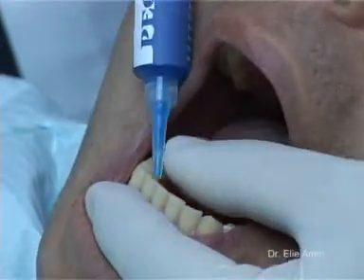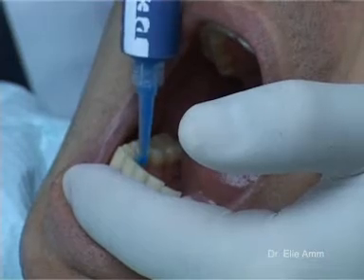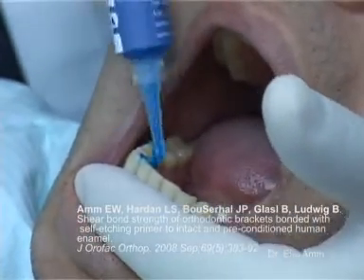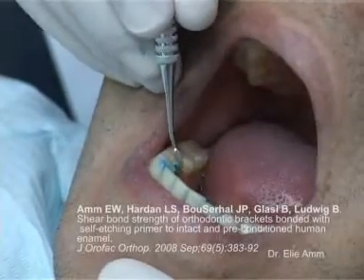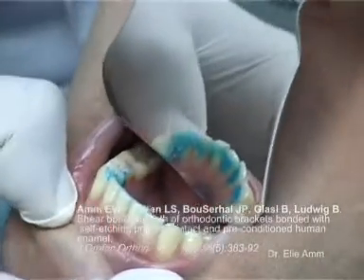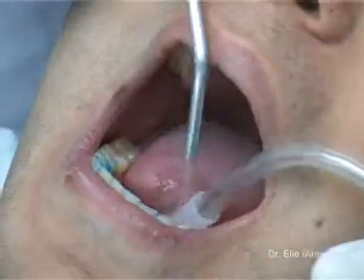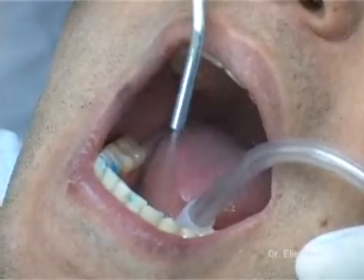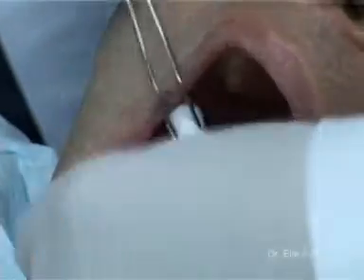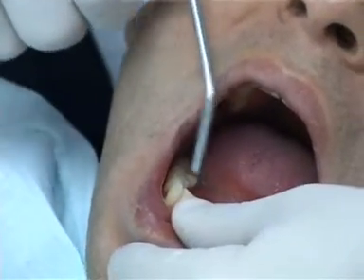Then we apply etching gel of 37% phosphoric acid, according to Am et al. in 2008. The bond strength seems to be higher when the enamel is prepared with acid etch before the use of self-etching primers. Cleaning of the acid etch thoroughly with water spray. Isolation with cotton rolls. Air drying of the surfaces to be bonded.